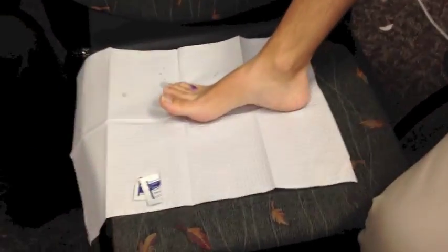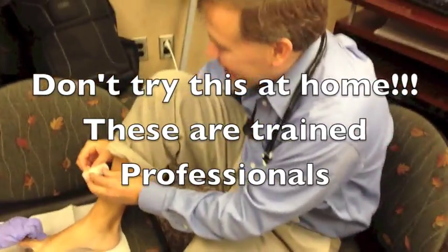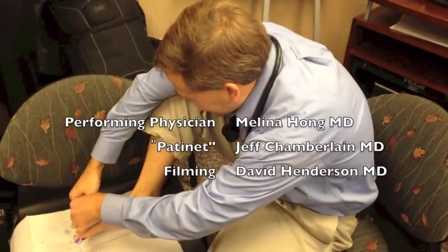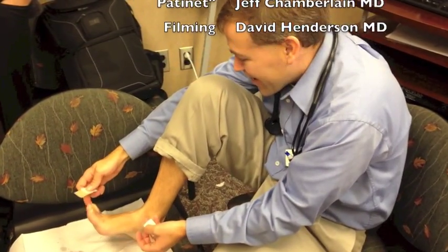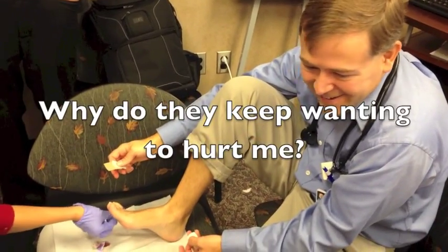It really hurt, I'm sorry. It just hurts, you know — it's like getting a shot. How's your toe feel? Is it numb? Poke the end with a needle — yeah, you need to test sensation. Let's remove the toenail.